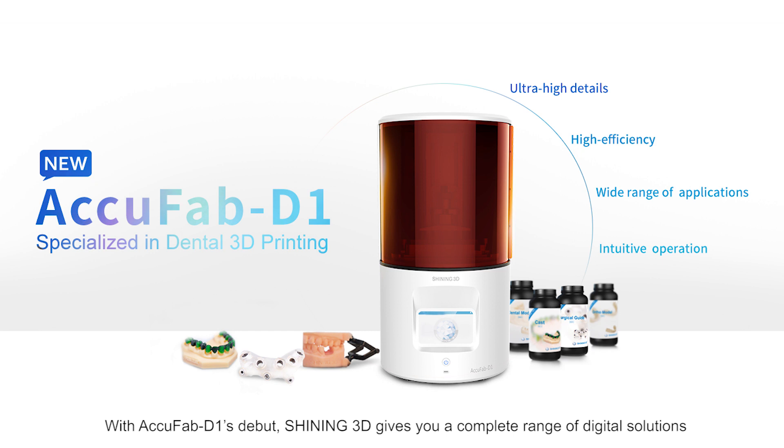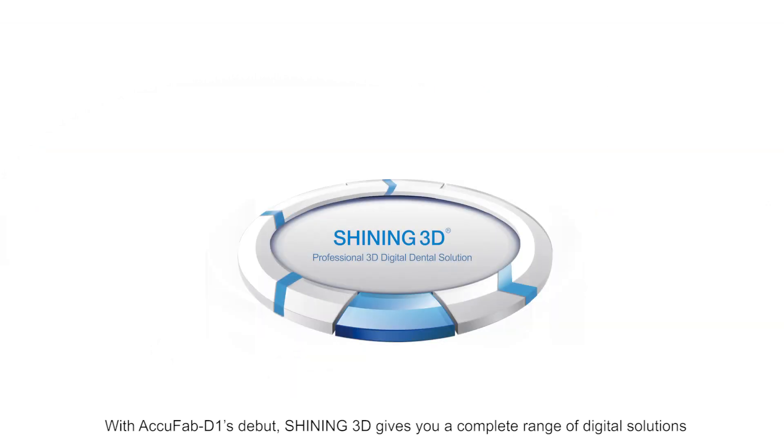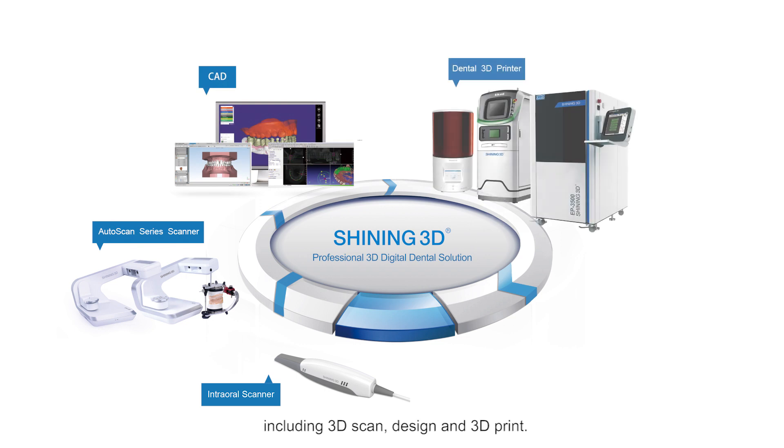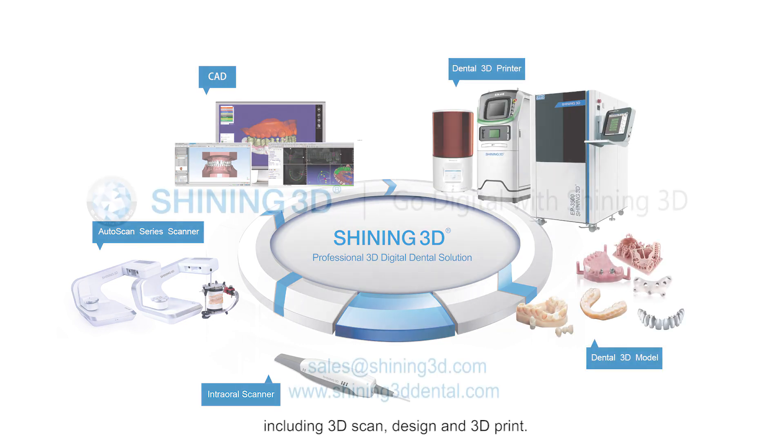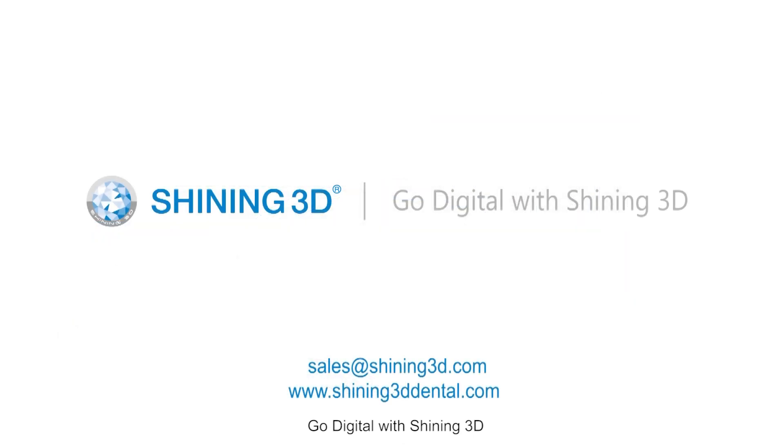With AccuFab D1's debut, Shining3D gives you a complete range of digital solutions, including 3D scan, design, and 3D print. Go digital with Shining3D.